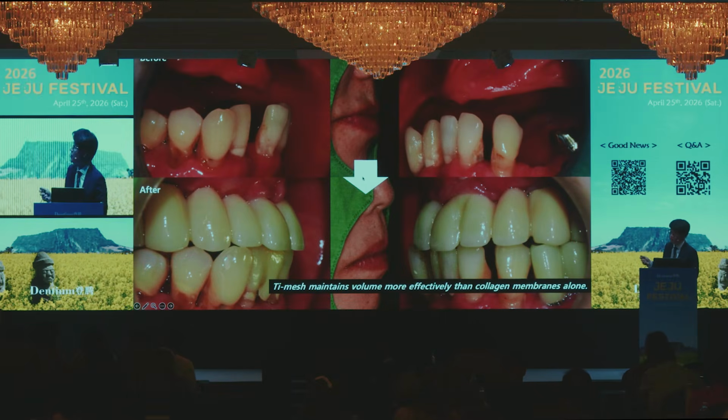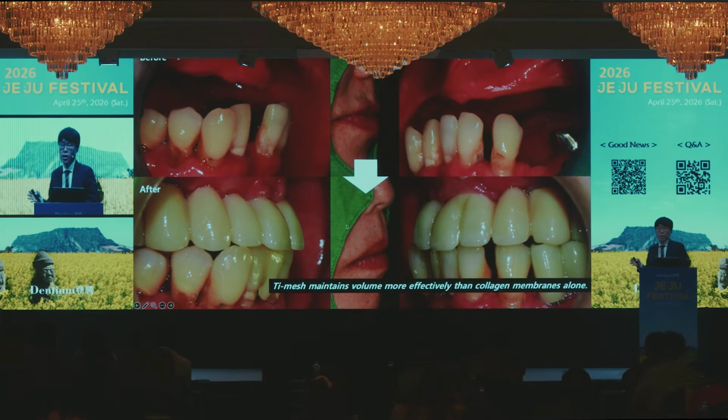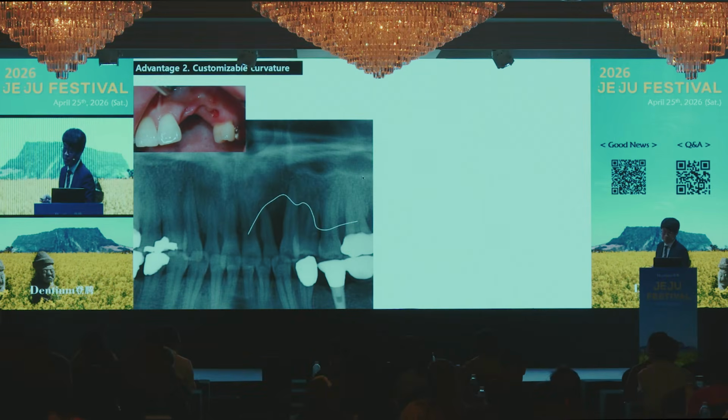And not only that, we could also see the patient's facial profile was improved too. So overall, titanium mesh allows us to achieve both functional and aesthetic improvement in challenging cases.